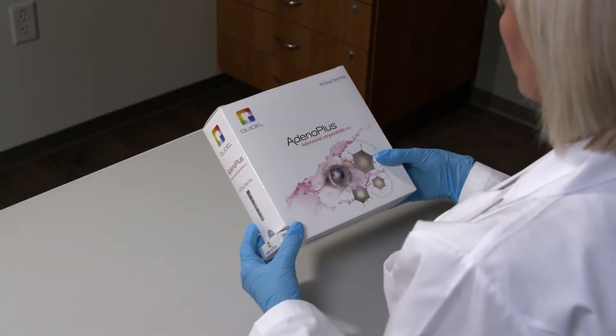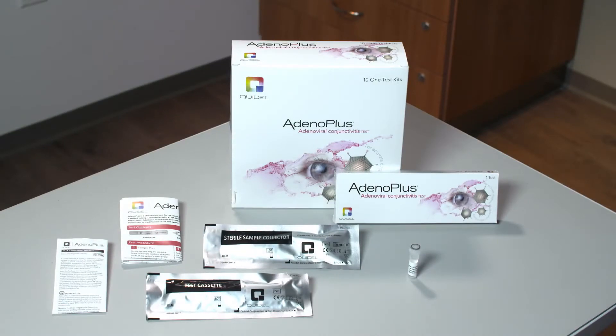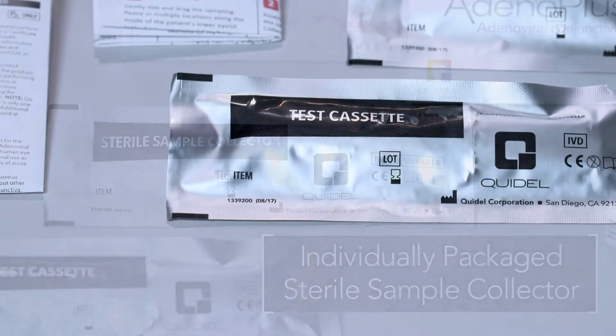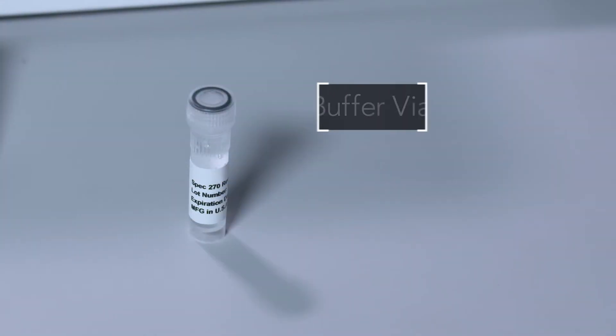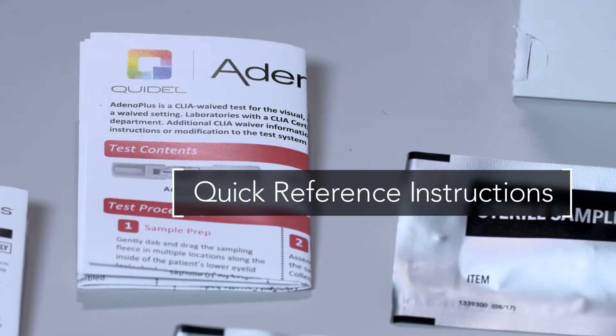The Adeno Plus kit comes with everything required to collect the patient's sample and perform the test: an individually packaged sterile sample collector, individually packaged test cassette, buffer vial, package insert, and quick reference instructions.